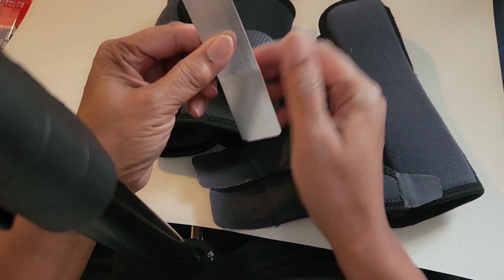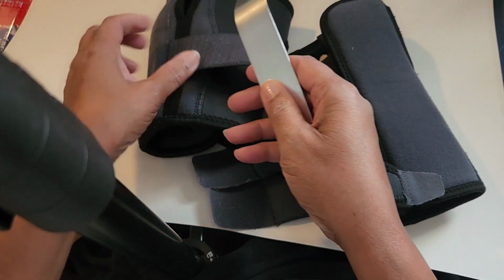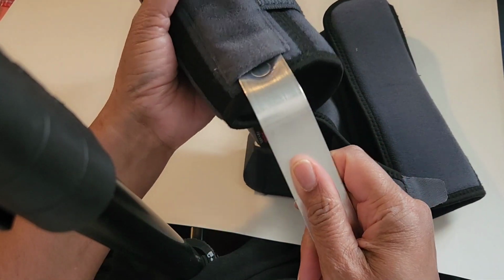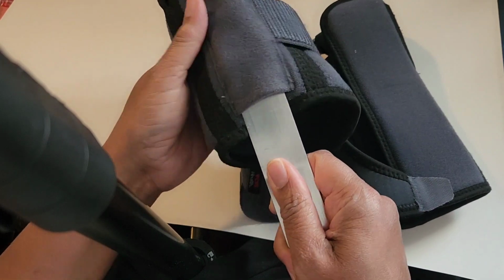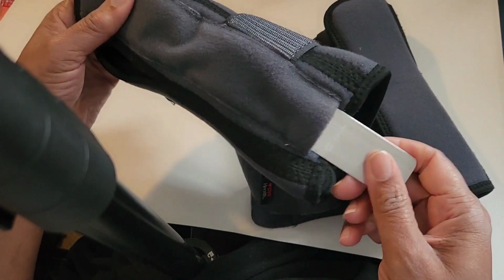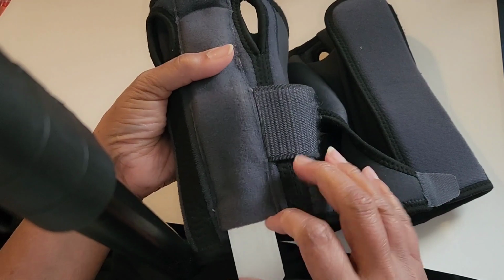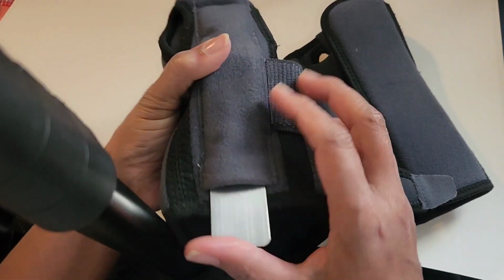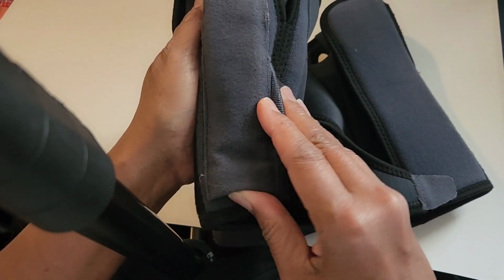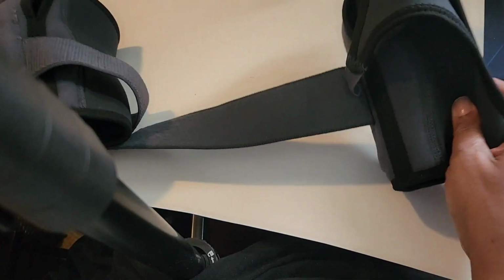So basically this brace is supposed to fit over the wrist like that. It helps the median nerve, which is causing the problem. I guess repetitive things like typing and using the hands can cause the numbness. Some people have pain, but right now I'm in the beginning stages, so he's trying to avoid me getting worse. So that's why I'm wearing this. I only have to wear it at night, so this brace can stay in there. But let me show you how I wear it.